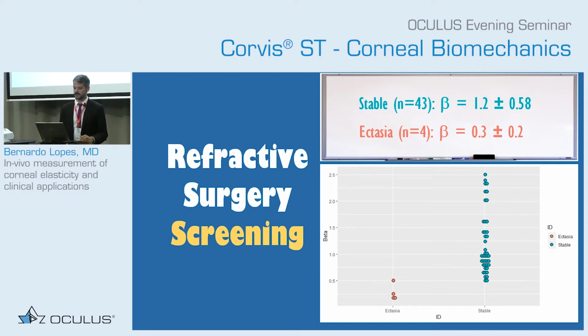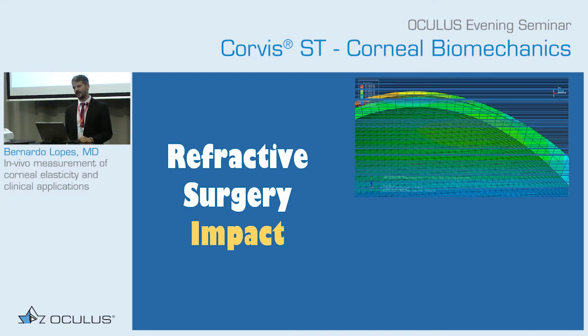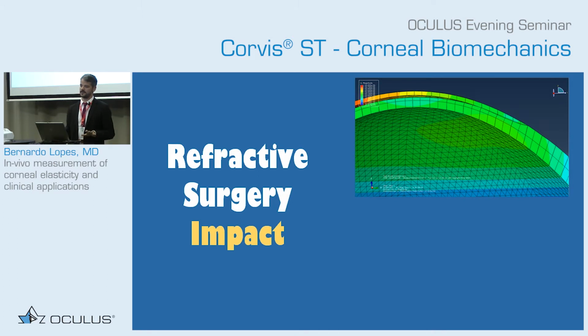A stable cornea would have an average beta of 1, which should be normal, and below 0.5 should be expected to be keratoconus behavior. And in the ectasia cases, they were behaving like keratoconus. They are soft corneas. We still only have 4 cases, so we cannot rely on that yet. We're trying to get more cases. They are really hard to get. Renato has this quest to get pre-operative and post-operative tomography. So we're getting more to increase this number and get more reliable results.